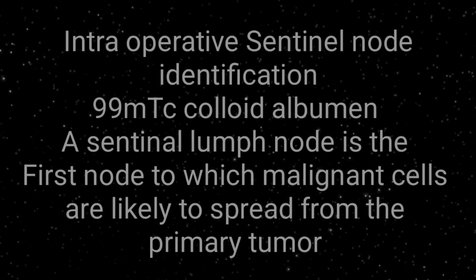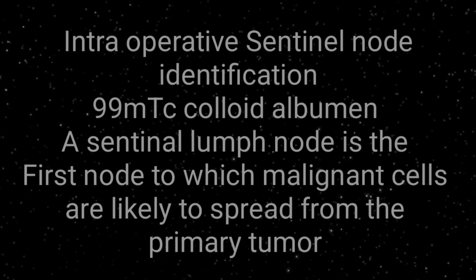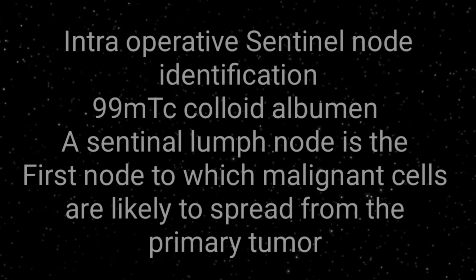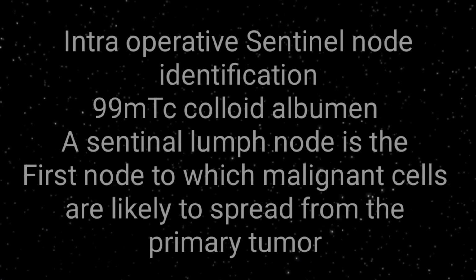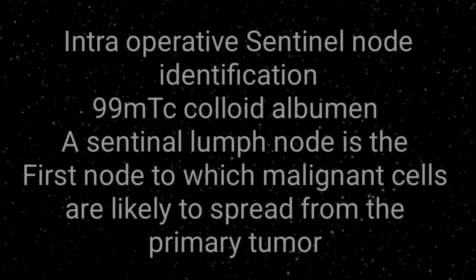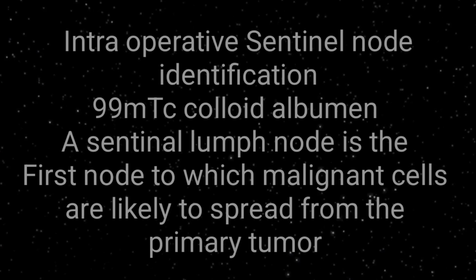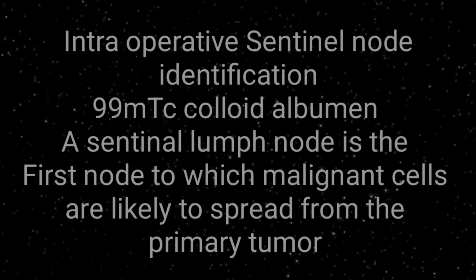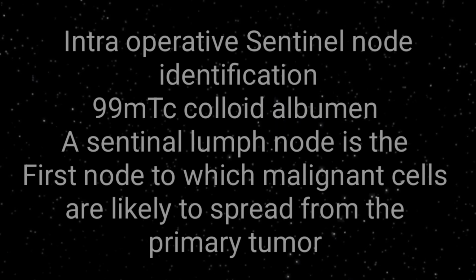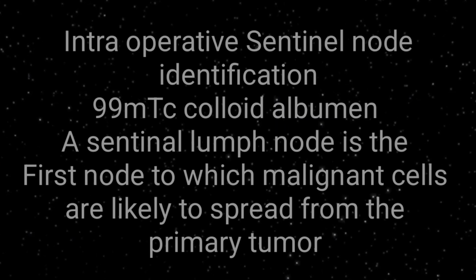Radionuclide imaging is another technique for breast imaging, particularly for the detection of lymph node invasion by malignant cells. This technique is actually intraoperative sentinel node identification. A sentinel lymph node is the first node to which malignant cells are likely to spread from the primary tumors.